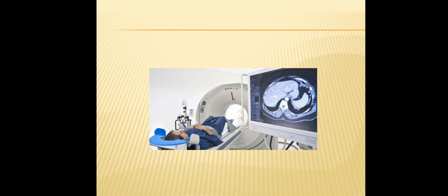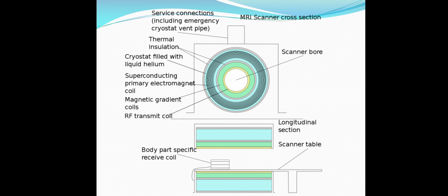nervous system. In addition to detailed spatial images, the sustained increase in demand for MRI within health systems has led to concerns about cost and effectiveness and overdiagnosis. The mechanism is quite complicated actually.